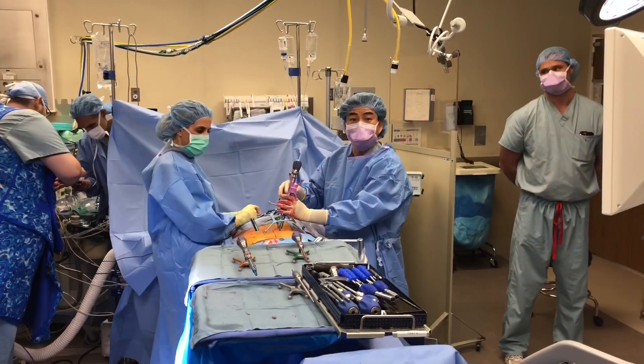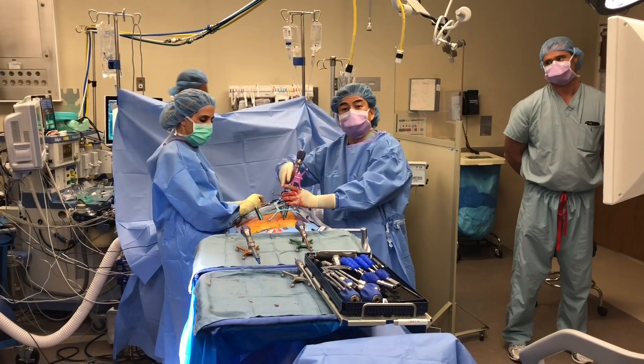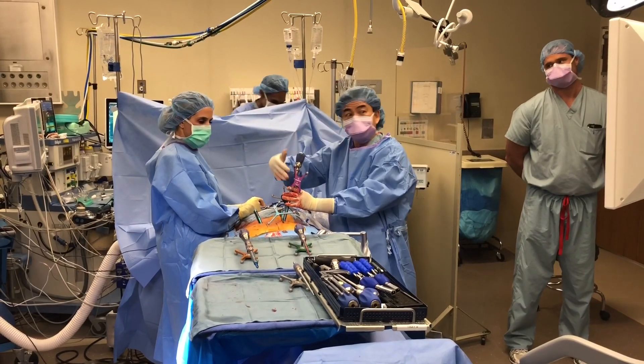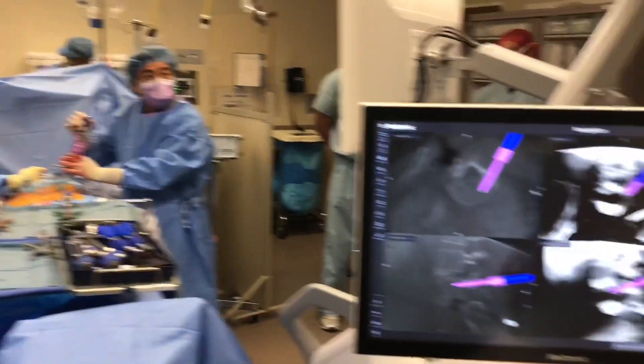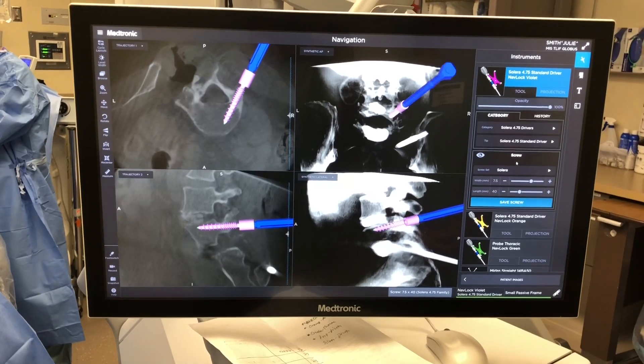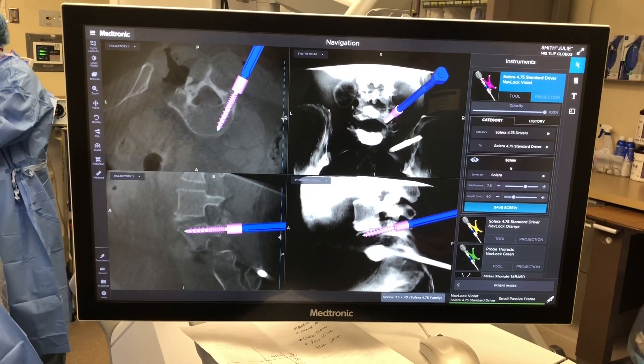The surgery is going really well. I've already done all the interbody work and I'm starting to put in all the screws. Again, I'm using navigation — the camera is looking down in here and we can look on the screen. This allows me to put the screw in exactly where I want. You can see it's right inside the bone, and it's a really, really good bite.